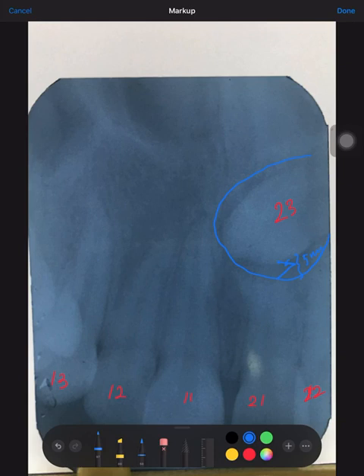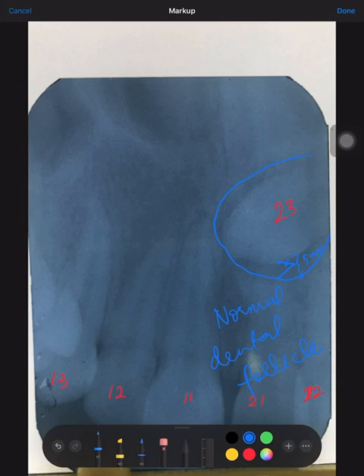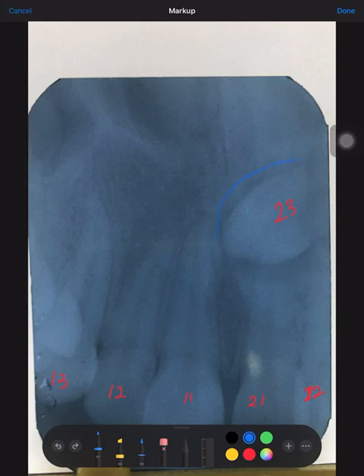Anything less than 5 mm should be considered a normal dental follicle surrounding an impacted tooth. So what is our diagnosis now? Follicular cyst? No — normal. It is not a dentigerous cyst, not big enough. It is just a normal dental follicle, not a cyst. This is just a normal dental follicle. That is about it for this radiograph.